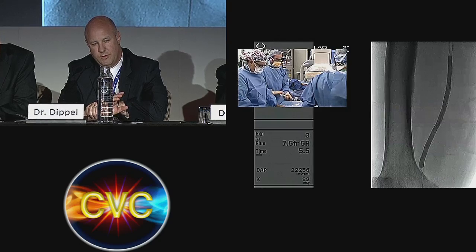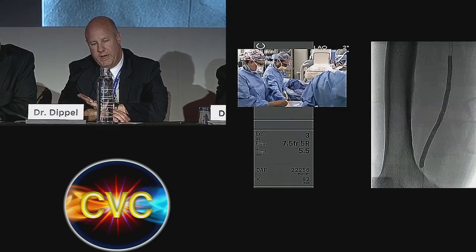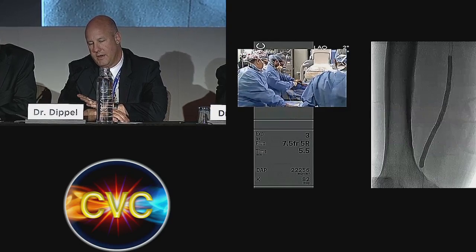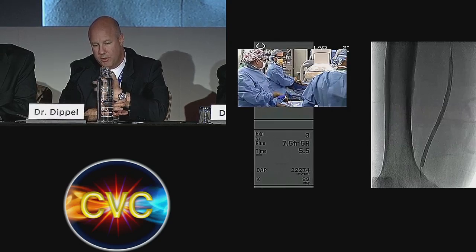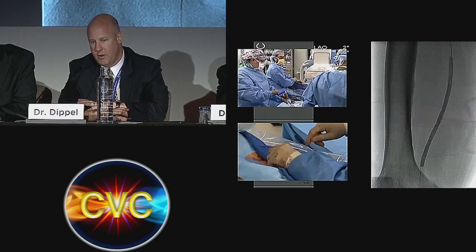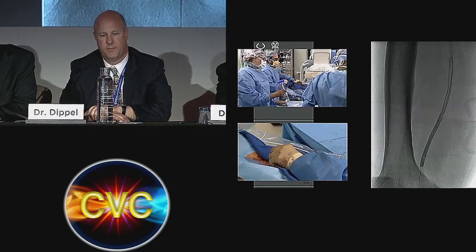But the drug-eluting stent coronary trials that have been done in Europe show patency rates in excess of 90 to 95% at 12 months. And so I personally would not hesitate at all to put a drug-eluting stent in that lesion in the anterior tibial artery.